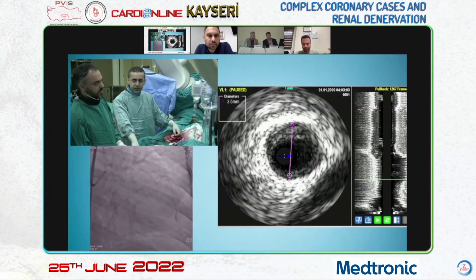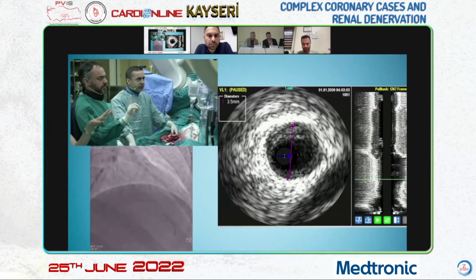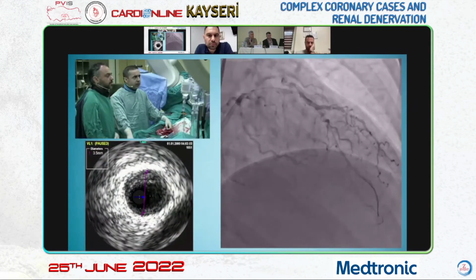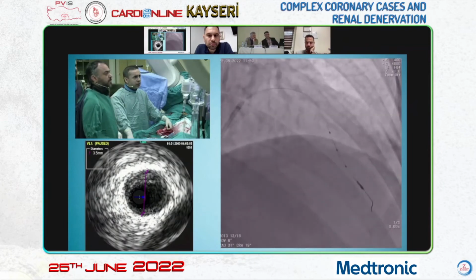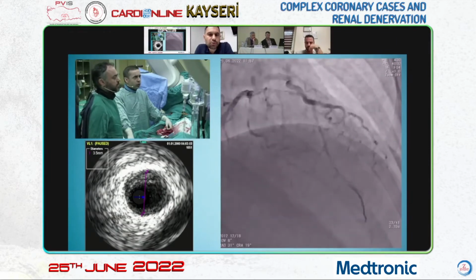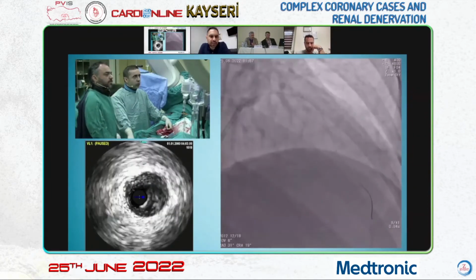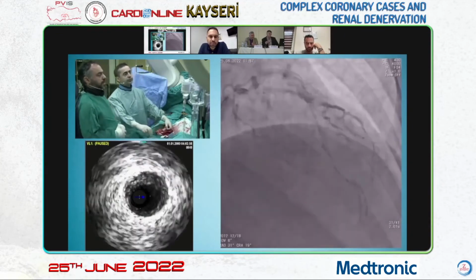We have a 2.5 balloon, in proximal and distal, as you can see. Go back a bit. Go back. Another go back. Go back. What do you say, Professor Ali, in this regard? Ali says that it seems a bit serious.